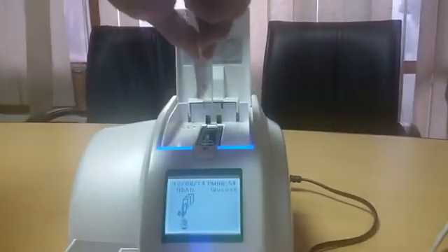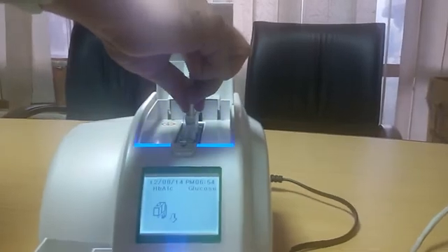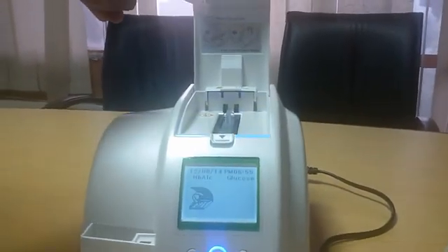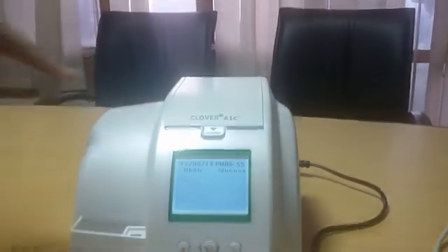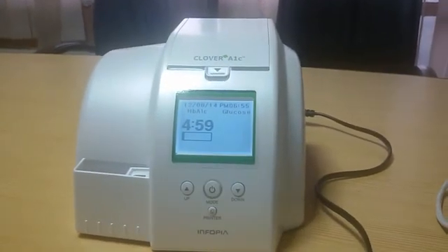Insert the filled reagent pack into the blank cartridge until it fits — you will hear a click sound. Now close the cover and wait for five minutes for the results.